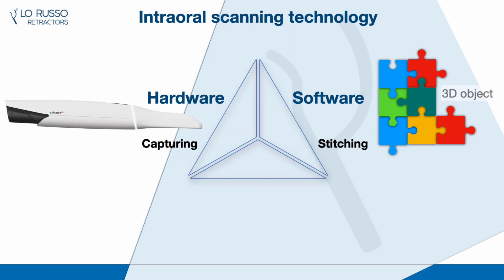To understand the impact of strategy, we must look beyond the standard dual-component model of intraoral technology, which typically focuses only on the hardware capturing images and the software building the 3D object. This conventional view is missing the most critical factor in the digital workflow, your hand. The operator is the active interface that determines the success of the technological components.